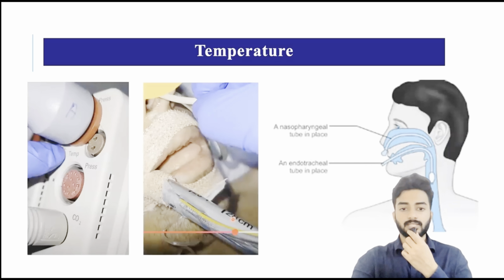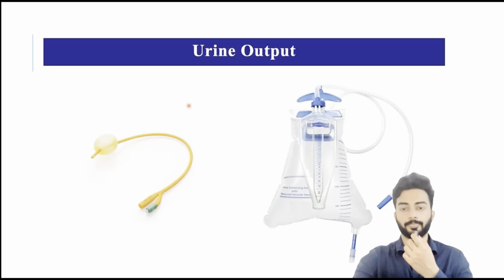So this is the nasopharyngeal tube, and we put the nasopharyngeal temperature probe inside and it is connected to here. Here I am showing how we put the nasopharyngeal temperature probe.